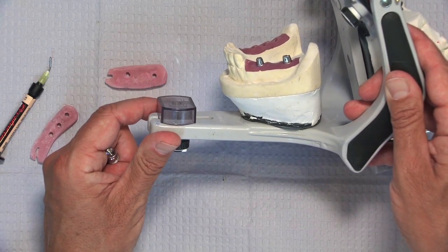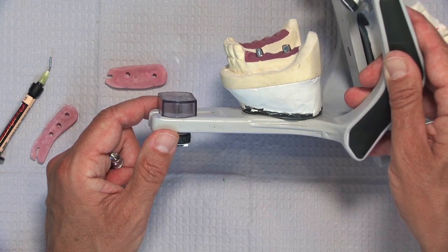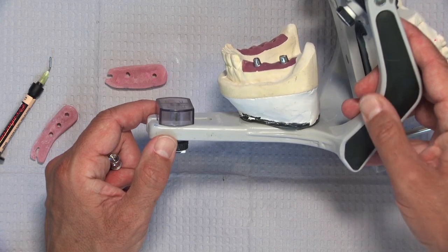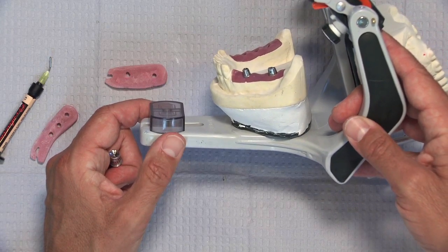Always got to make sure that we get, and this is one of the great reasons to have digital radiography, to be able to take a quick picture and just make sure that these implant components are in fact seated all the way. A lot of times we're dealing with stuff where it might be 3, 4, 5 millimeters subgingival, and visually you just can't check. And you also can't assume that because the screws stop turning that everything is seated all the way.